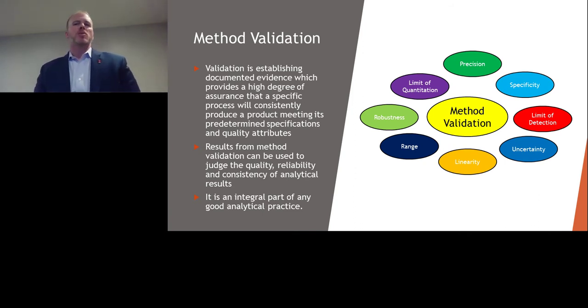So there's a lot of different components within method validation that you'll have to keep in mind as you're setting up a validation plan. And there's a lot of different resources out there to be able to get all the different components together. It's really important to take time and walk through this validation plan slowly and keep notes and document everything that you are doing and all of the data, so you have it in one spot to be able to put together a package to really show your method is up and running at a high quality.